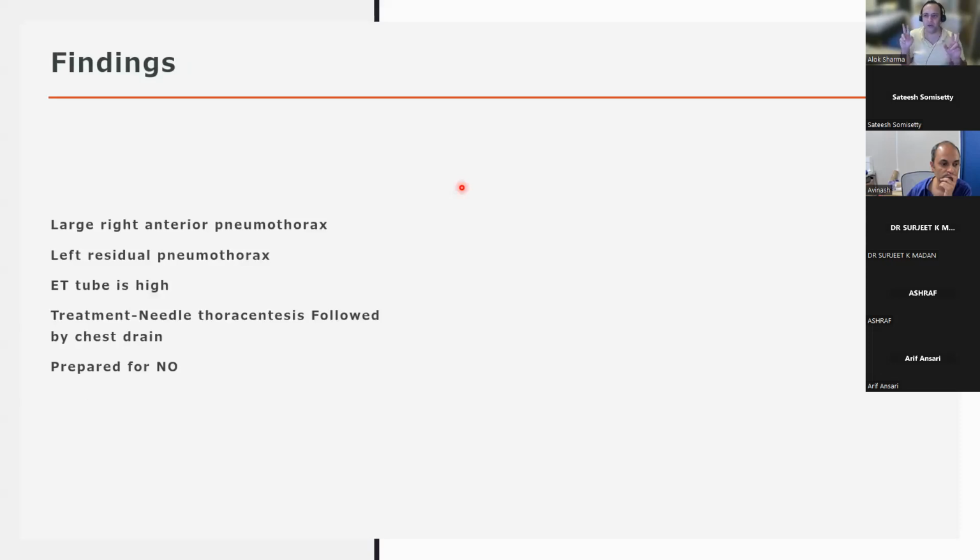So these are just two cases where we haven't done chest X-rays, where really, from our perspective, we have used lung ultrasound to change our management. Now, you could argue, let's do an echo. And I did an echo in this baby after the chest drains were in, and the duct was shunting completely right to left. We had severe pulmonary hypertension. We put this baby on nitric.